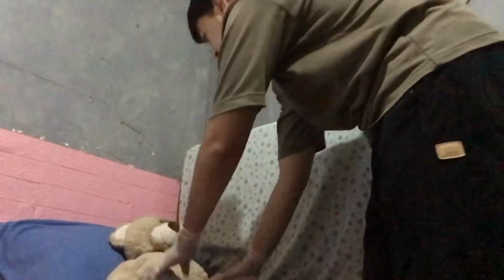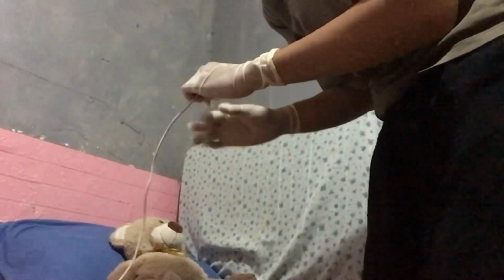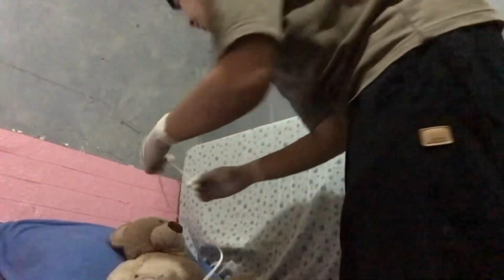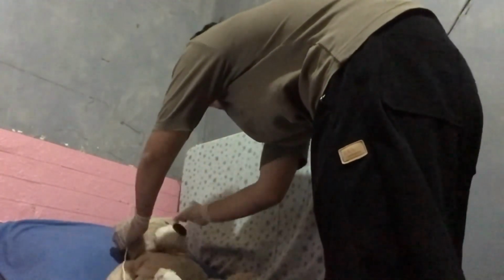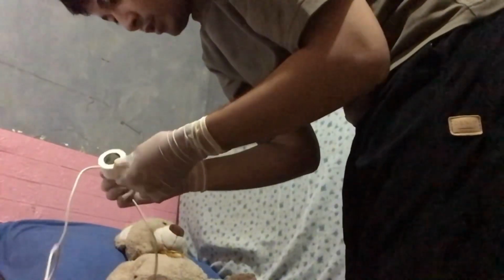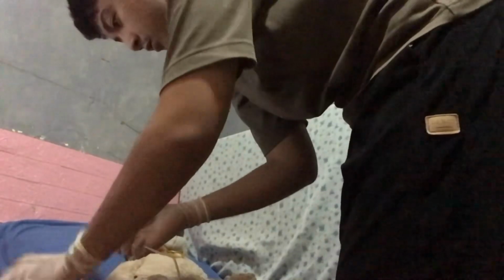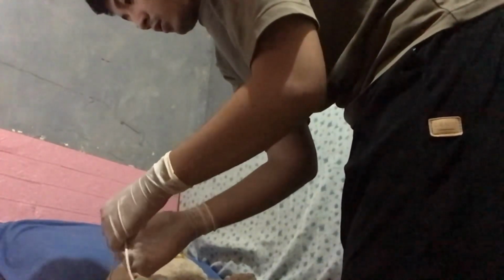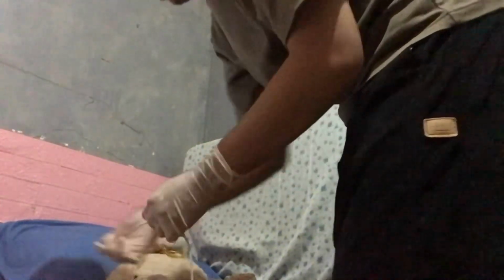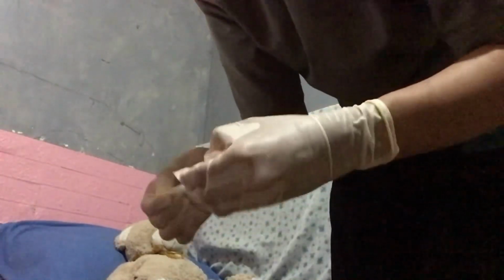So, okay, the patient is positioned in an upright position with head elevated. Now, next is to measure the length needed for insertion. So, from nose to earlobe, then to the xiphoid process. So, we must mark the tube. Mark, mark na natin. So this will be used for securing the tube.